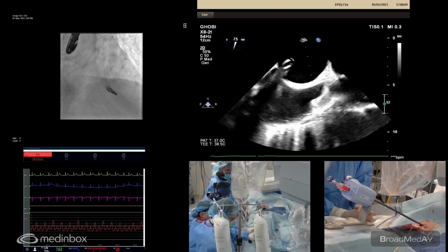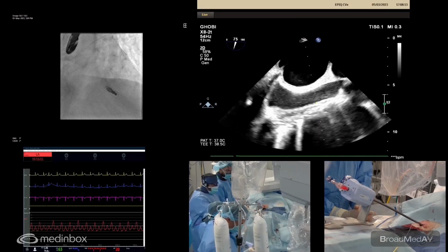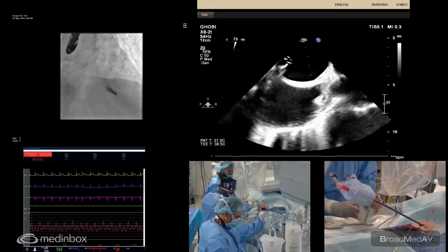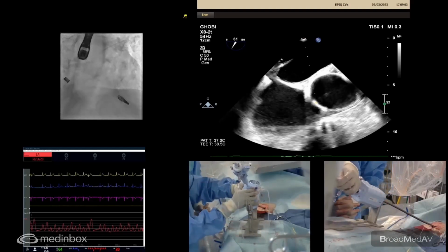Our speed is, I mean, we've actually done about the first clip, which is the most important to put in. We've decided to use an XTW, and now we're going to advance the clip inside. Just hold it like that for me, please. And I'm teaching him, Christian.